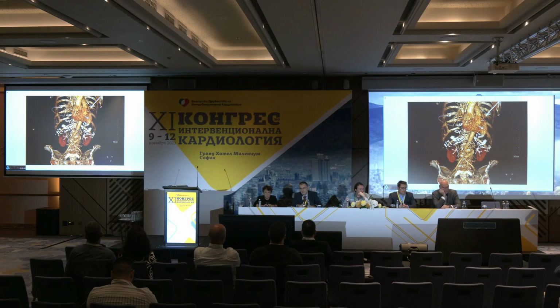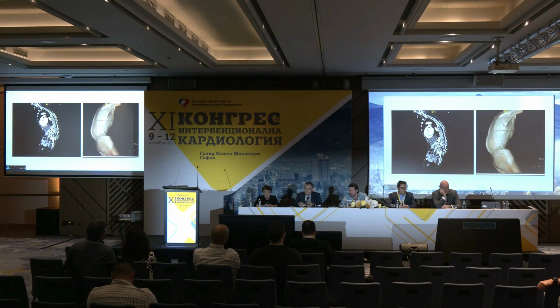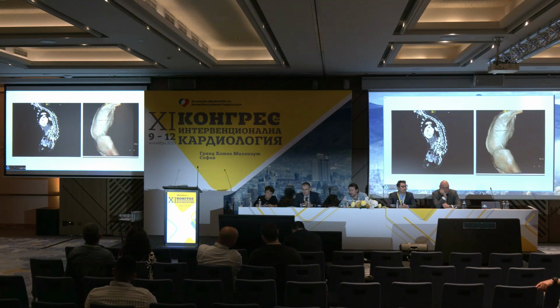And now you're able to see the extreme tortuosity of the aorta with, I would say, a double arch of the aorta in the infrarenal segment. It's enlarged here. This shows us the kyphoscoliosis of the vertebral segment of the woman, and basically when she's ambulating through her everyday life, she's bent over.